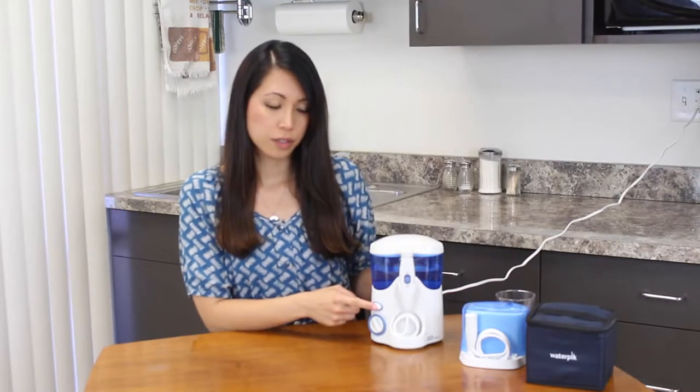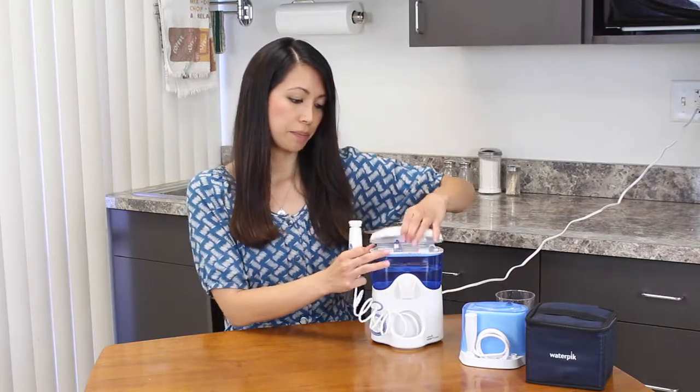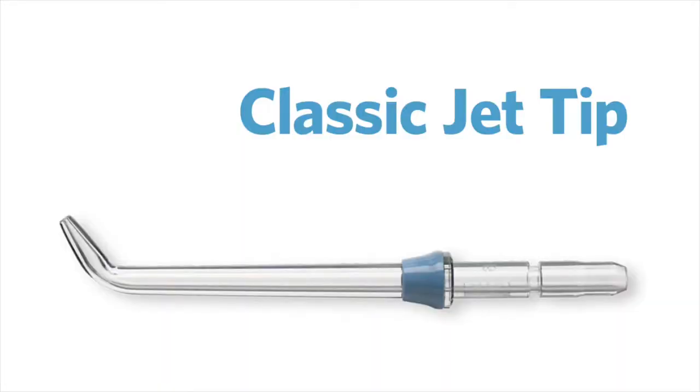So this is the power switch and this is controlling the water pressure. So you select your tip. The first one I'm going to talk about is the classic jet tip — it's for everyday use and you replace this one every six months.